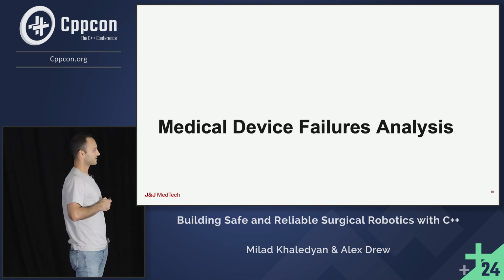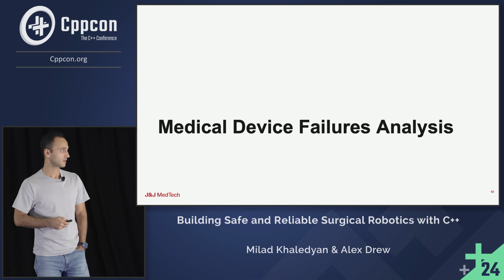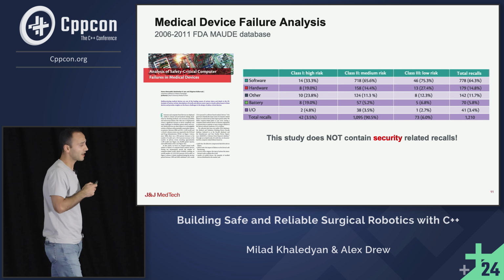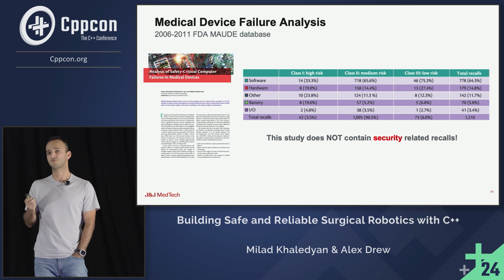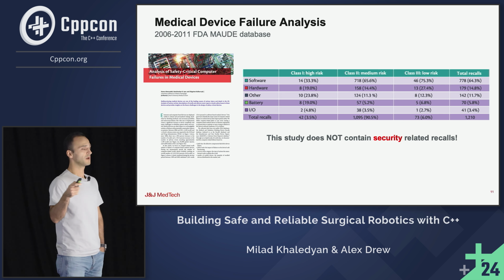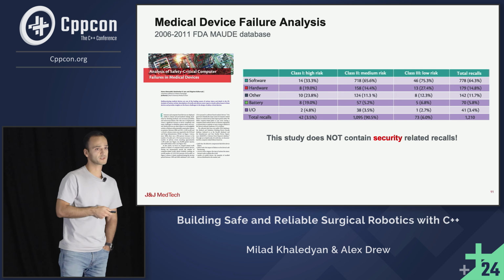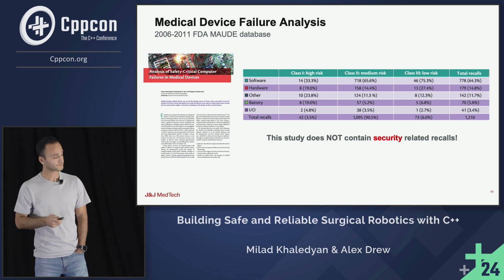So let's talk about medical device failure analysis and what actually causes medical device failures and recalls, based on some data. In 2013, this paper looked at the FDA, Food and Drug Administration, MAUDE database from 2006 to 2011. They basically looked at all the medical device failures and recalls. Some of them could cause injury, some could cause a lot of failures and maybe death in some cases. Without considering security, the conclusion was that 64% of medical device failures were actually due to software.